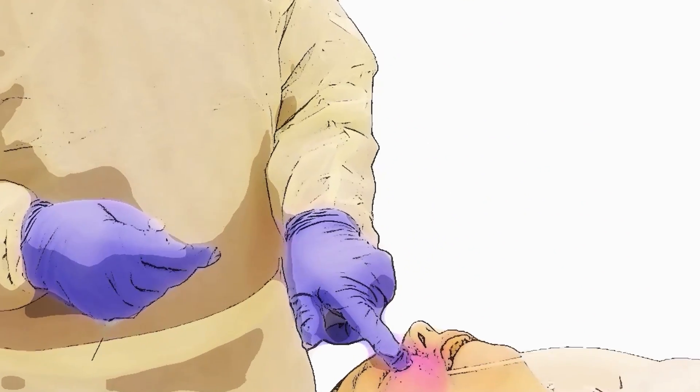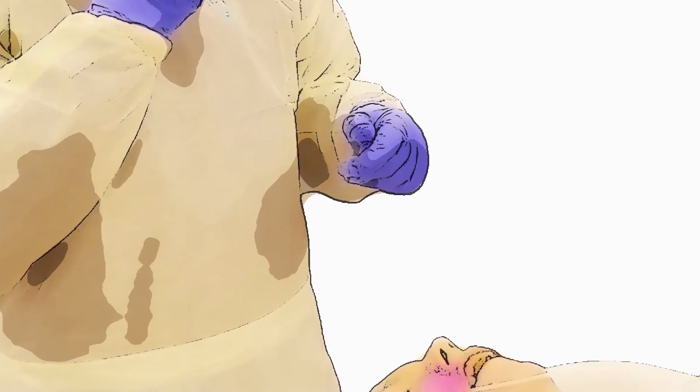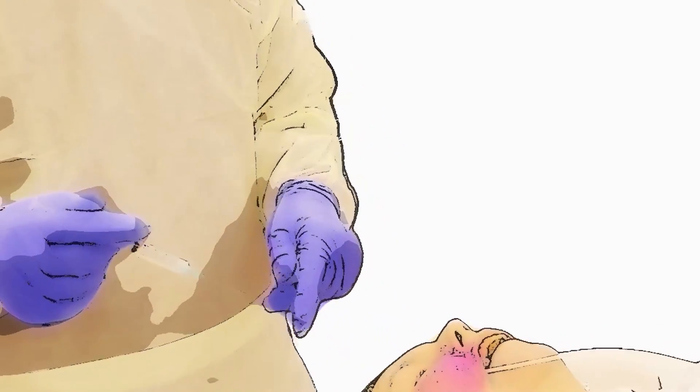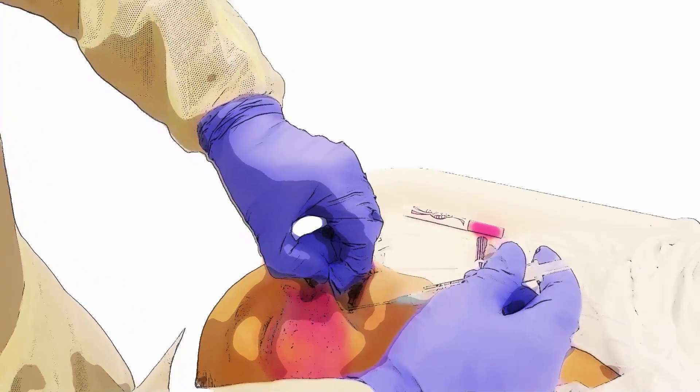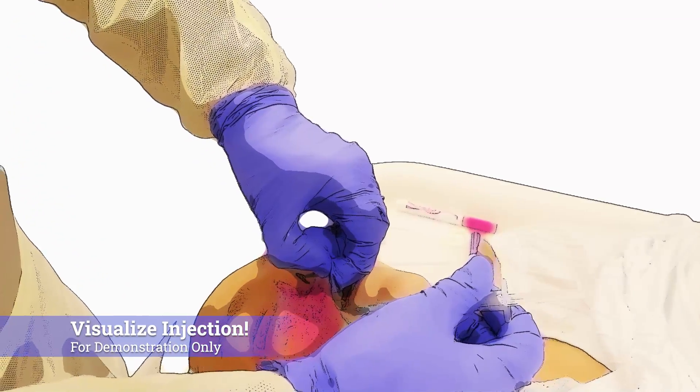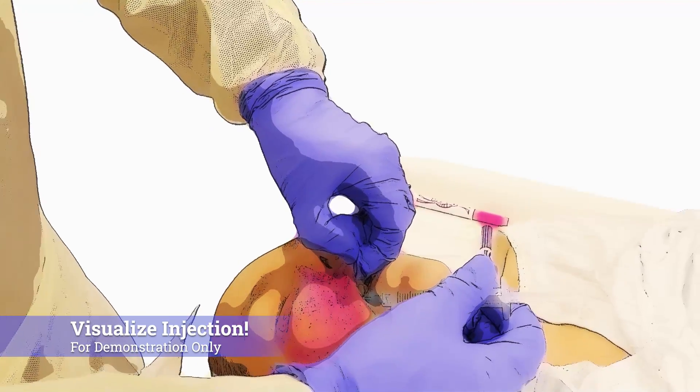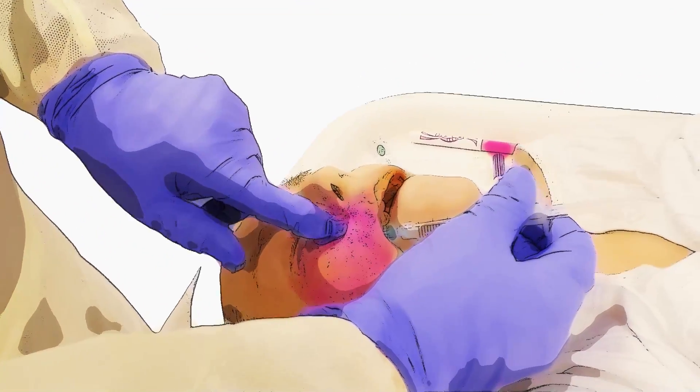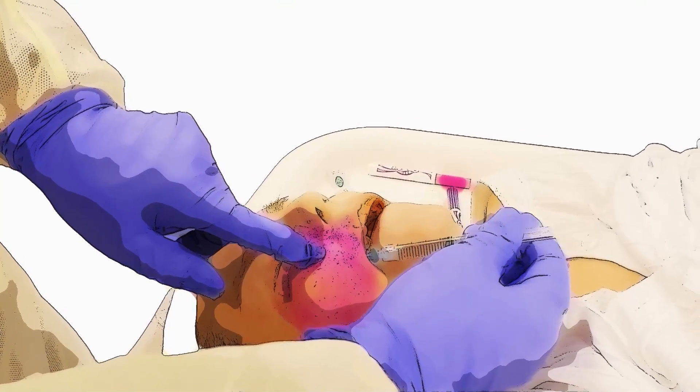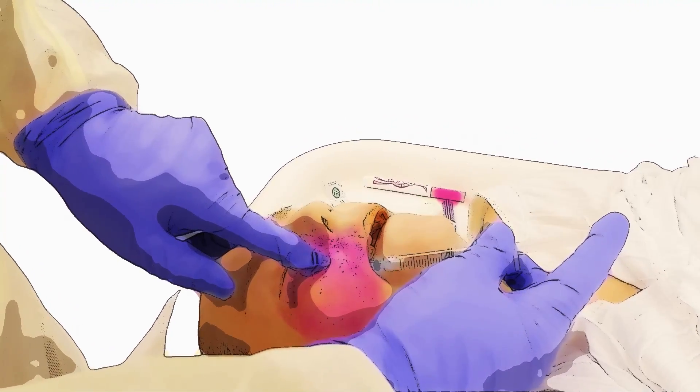I'm going to track upwards with my needle, just coming right up to the infraorbital foramen. You can feel your needle as it approaches the foramen, and then we're going to inject.